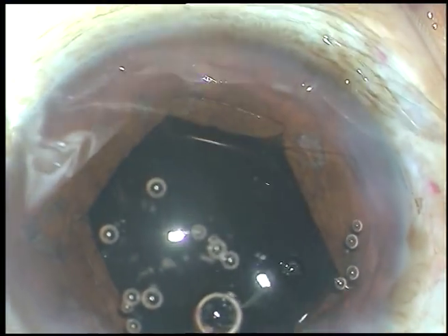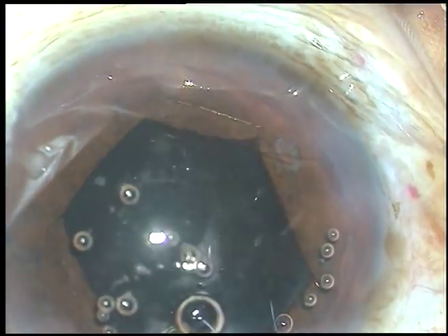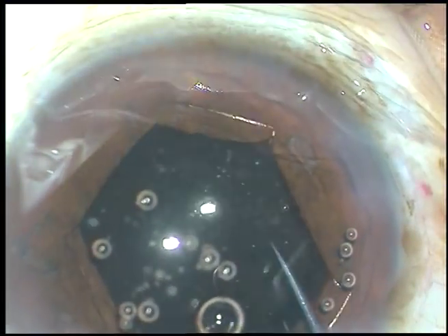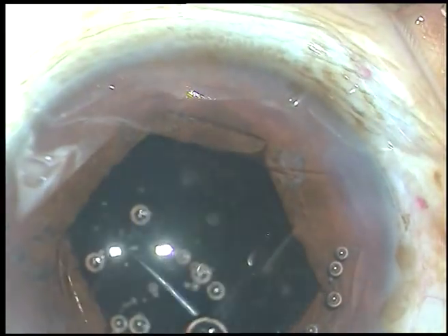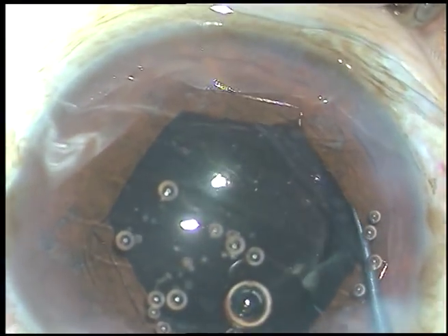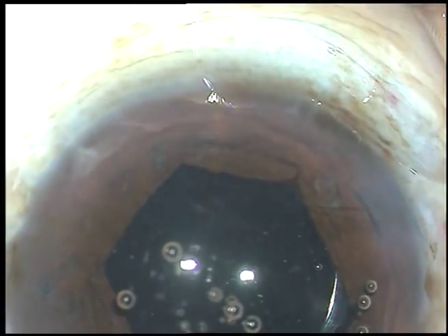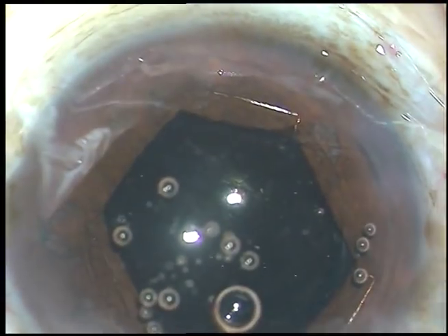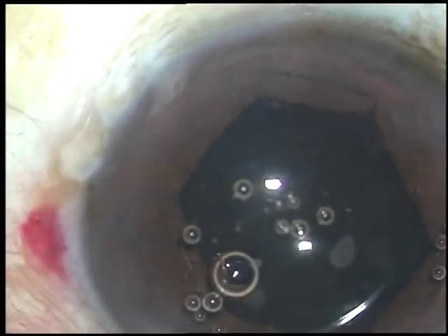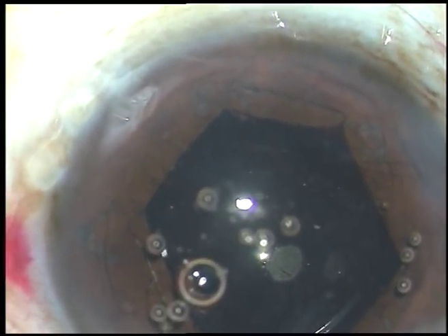The lens is now placed in the capsular bag. Just check whether it is in the capsular bag or not — retract the iris and retract the anterior capsular rim. If you can touch the anterior capsular rim, then the lens is in the bag.